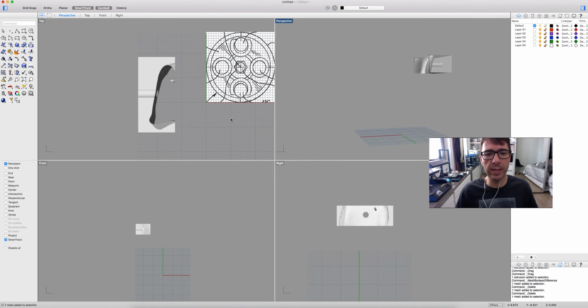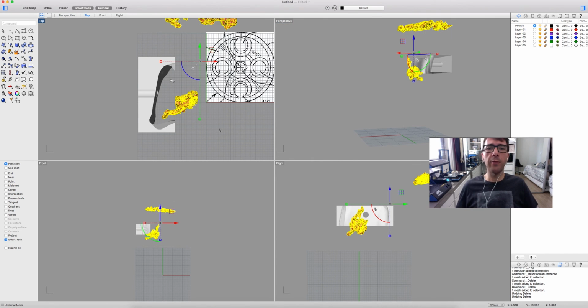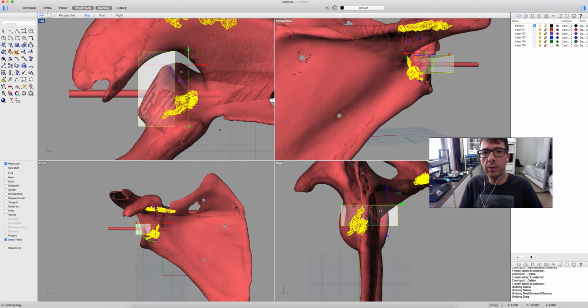And this is how we design actually every implant we do. Generally we take pictures. Sometimes we use the patents we found from Google. Sometimes we use only the PDF, and maybe if your manufacturer sends you, we can use it directly. Thank you for this video. This is a very quick video, but I think it was step by step. You can pause, you can test, and this is how we do it in actually any CAD software.